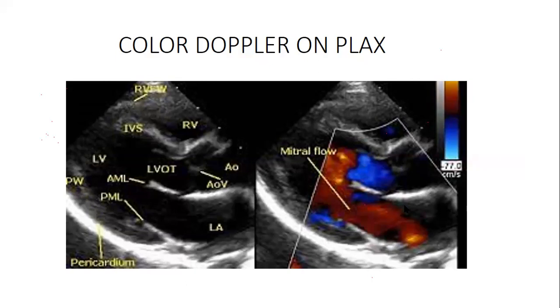Okay, thank you. So now blood is coming from here, the left atrium. It's filling here. Now, as it goes towards this side, the probe is here. Remember, it's at 90 degrees here. Okay, we are now learning a bit of physics. The probe is here, the beam is here.